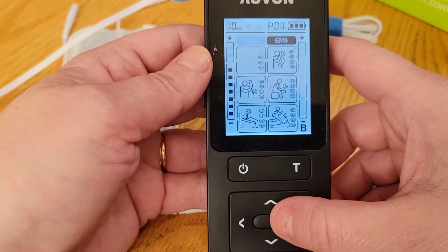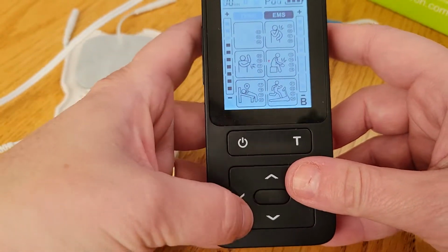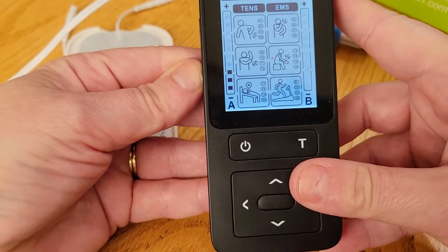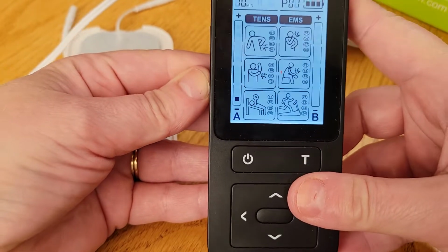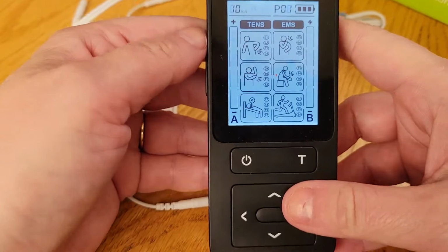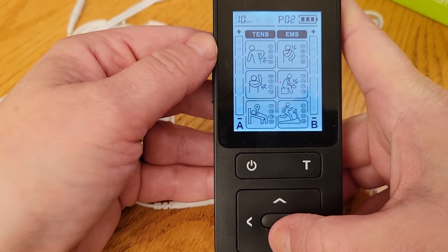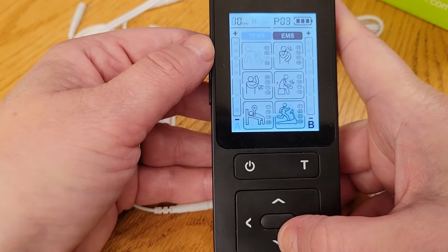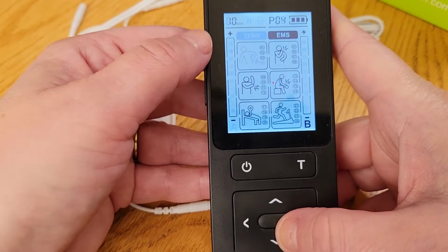Now, let's say you wanted to go ahead and change different modes. Within this one, there are 4 sub modes here. So you'll simply press the down button, and that changed it to 2, into 3, into 4.